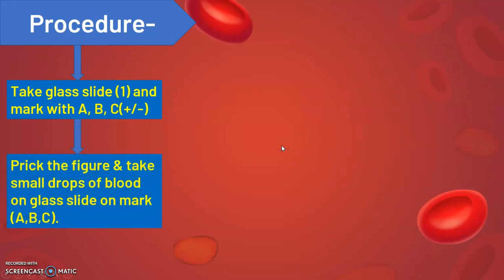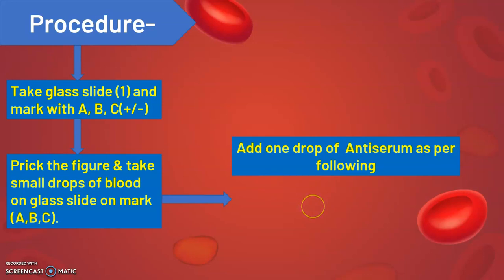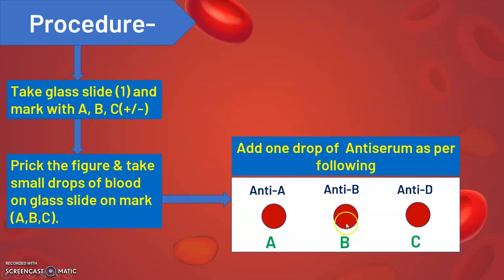Then prick your finger and take a small drop of blood on the glass slide. Next, add one drop of antiserum from the ABD kit to each marked point: at point A, add anti-serum A; at point B, add anti-serum B; and at point C, add anti-serum D to check whether it is positive or negative.